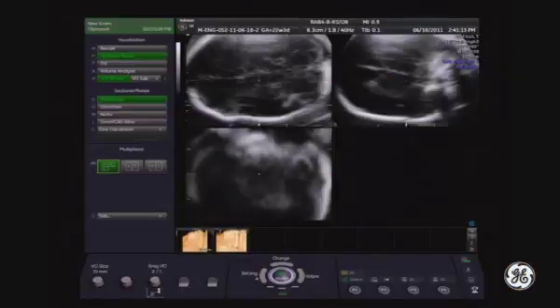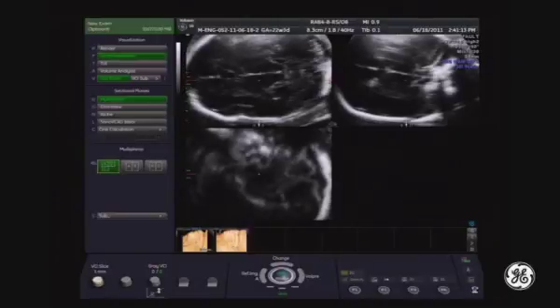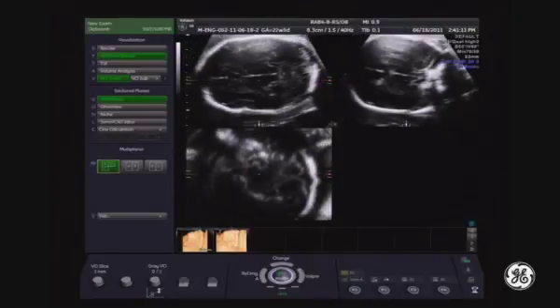First, I need to change the slice of my VCI because it is 20 millimeters at the moment. I will reduce to several millimeters, like 2, 3, not more. And I will decrease the size. Then I'll bring my pivot point exactly to the midline, and I will correct the position of the midline, and I will bring it horizontally, same as in A as in B. So let's do it.